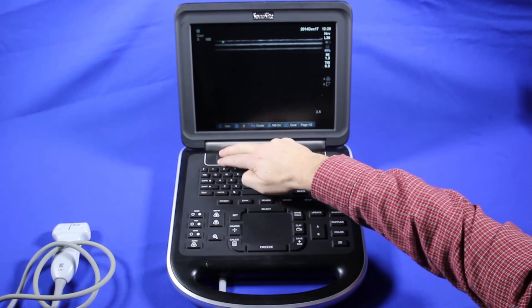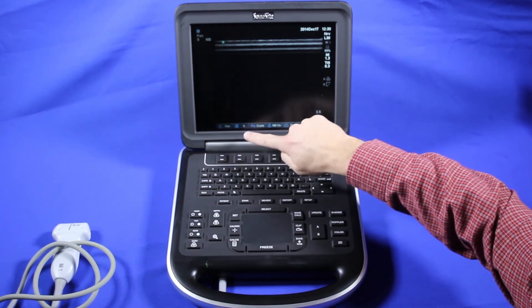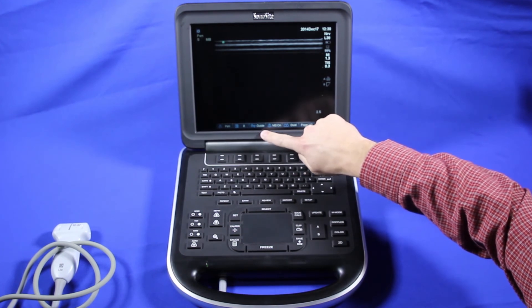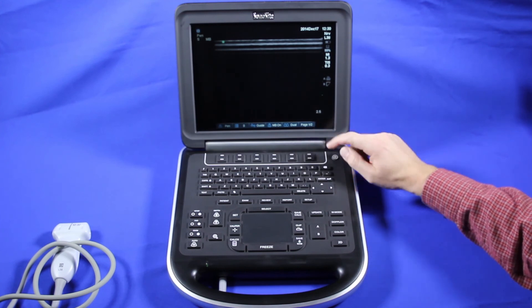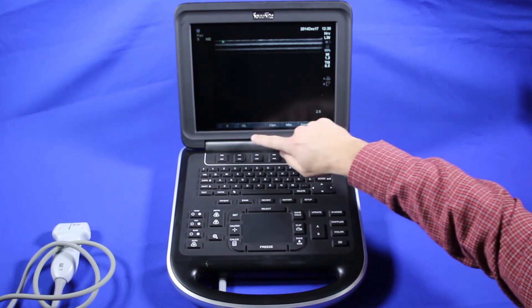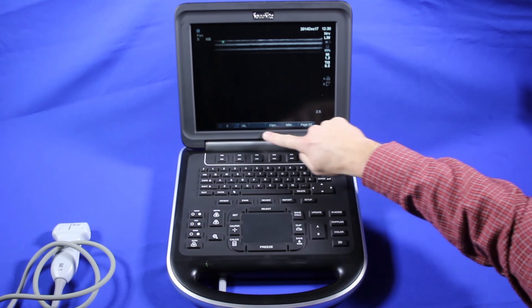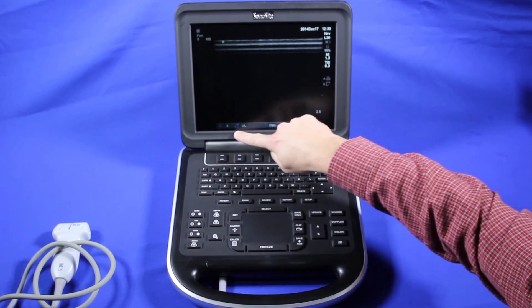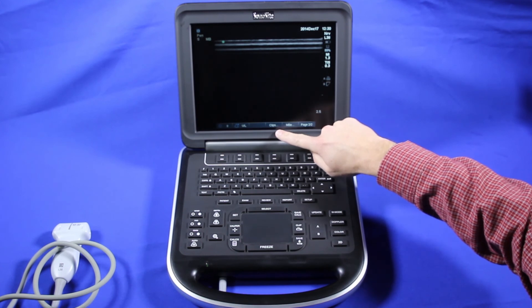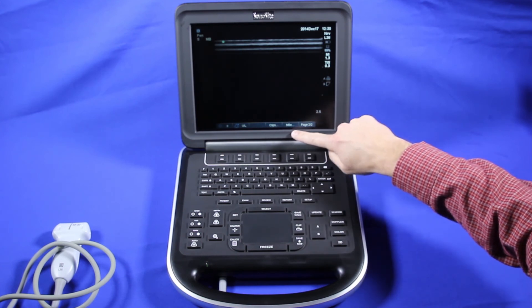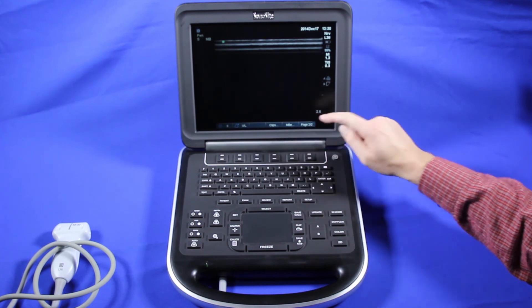Along here is where we would change the different imaging optimization settings. We have our dynamic range, our needle guide, and SONO MB for multi-beam imaging. We'll go through all of these in a different video when we cover image optimization and general imaging. You also have screen brightness, picture orientation up/down or left/right, where we set up clips, and set up our advanced needle visualization, which is SONO MBE.